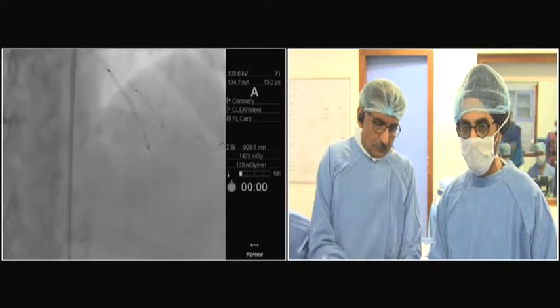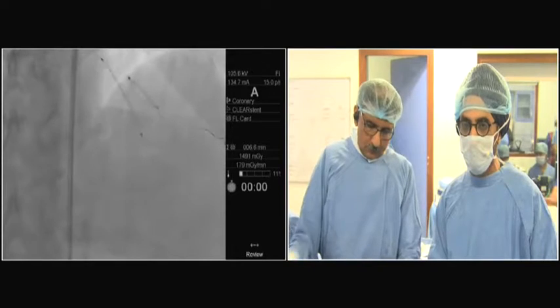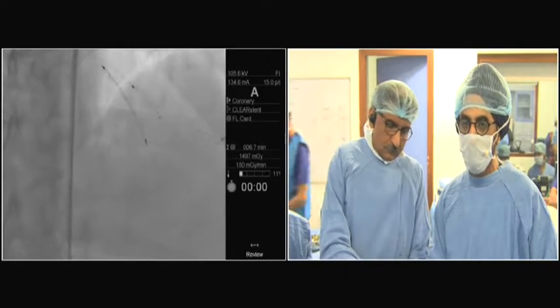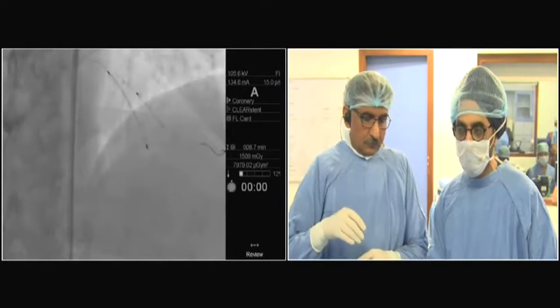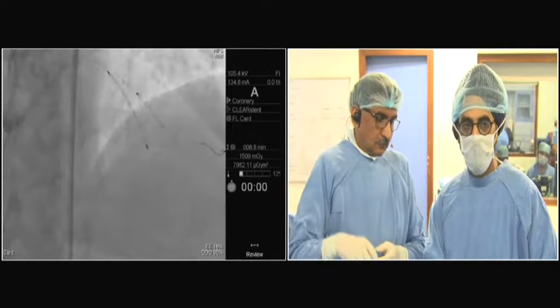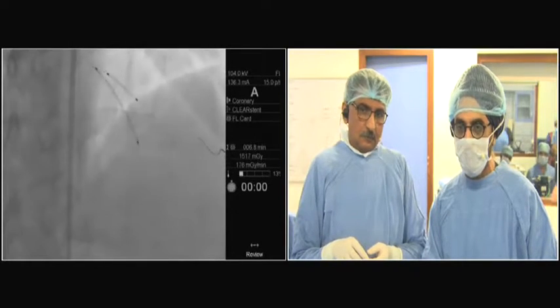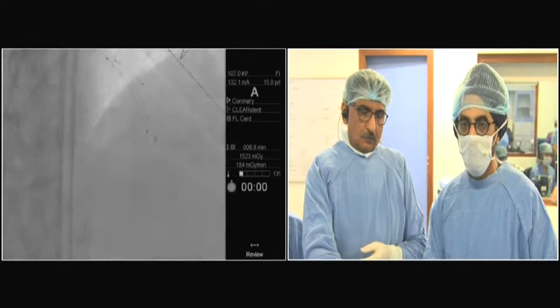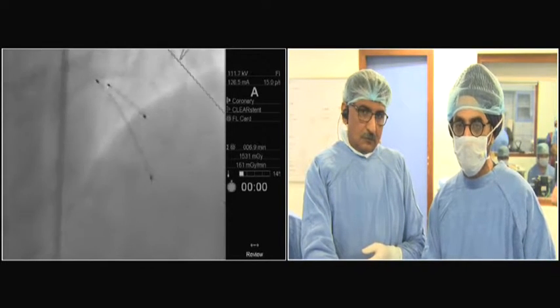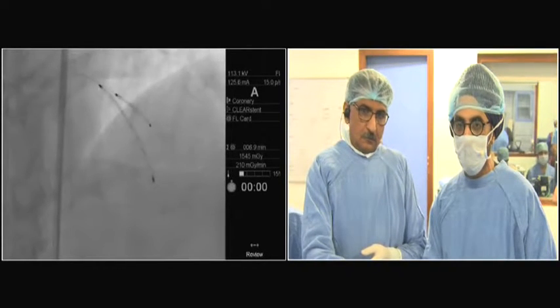So I'm going to place the stent very carefully just to allow me a POT with a 6 millimeter balloon. So I will use a 4 into 6 millimeter balloon to do a POT at that point. There may be a strut hanging in that dilated portion. I'm not going to really look at it, but I'm going to try to be as optimal as possible. If I can do a POT with a 4 into 6 millimeter balloon, I would be happy doing that.